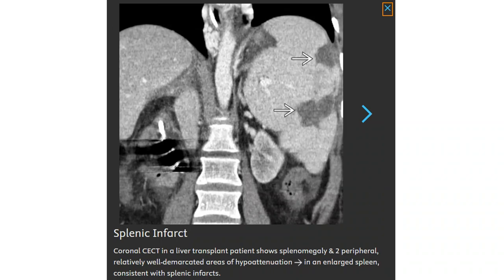Contrast-enhanced CT in a liver transplantation patient showing splenomegaly and two peripheral, well-demarcated areas of hypoattenuation in a large spleen, consistent with splenic infarcts.